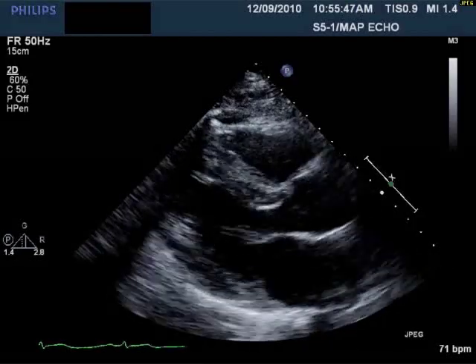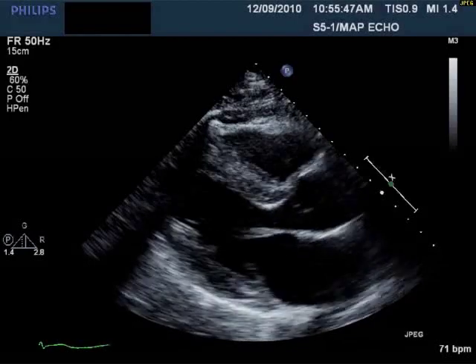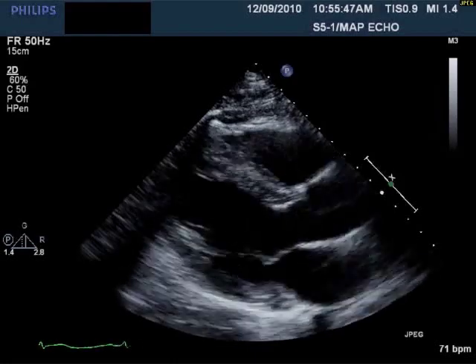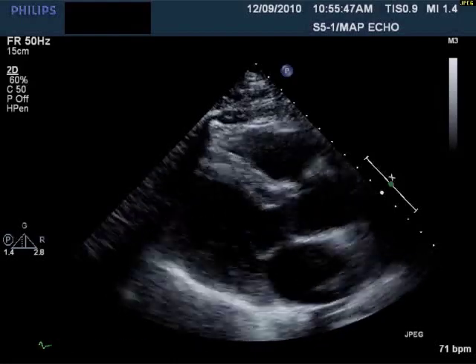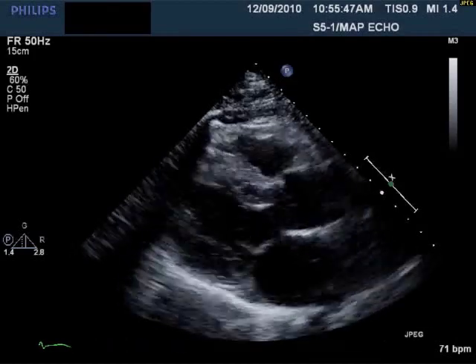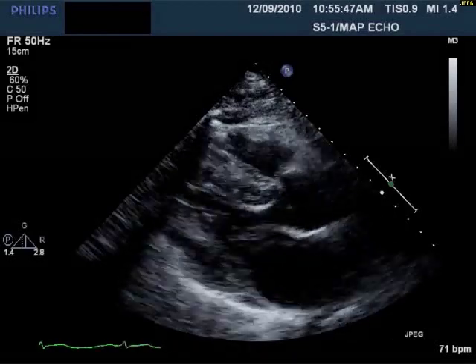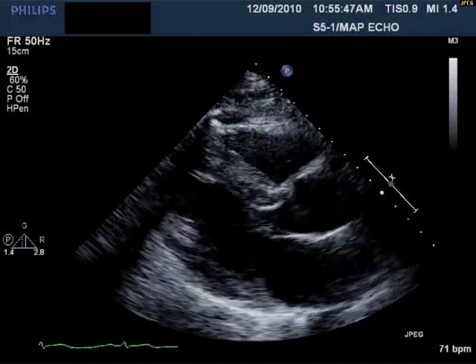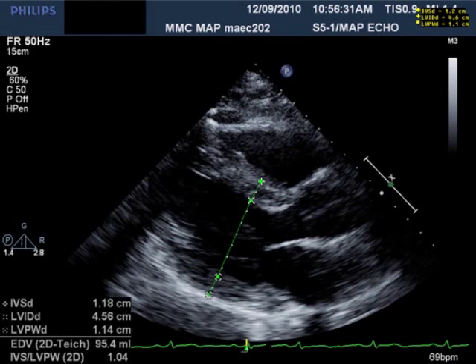This is a parasternal long axis from his echocardiogram, a 2D image — take a look at that. You'll notice that everything seems to be thickening normally. Both leaflets, the mitral and aortic, are both opening normally. You can see the measurements taken by the sonographer demonstrating minimal concentric left ventricular hypertrophy with a normal left ventricular internal dimension in diastole.